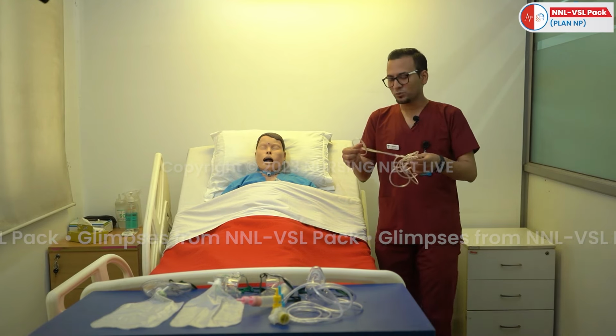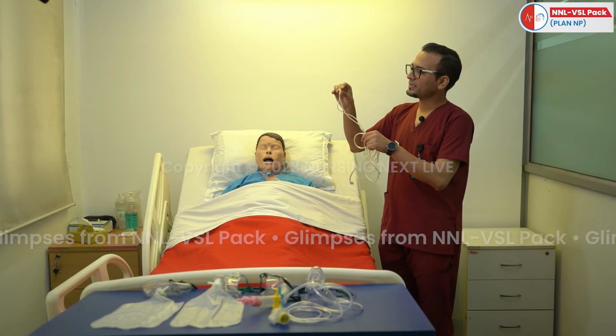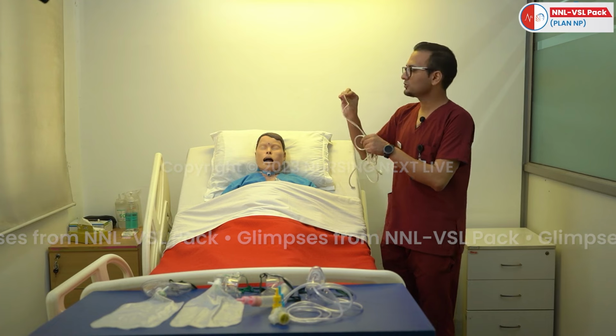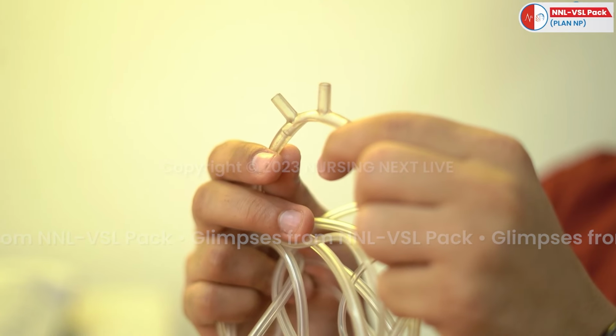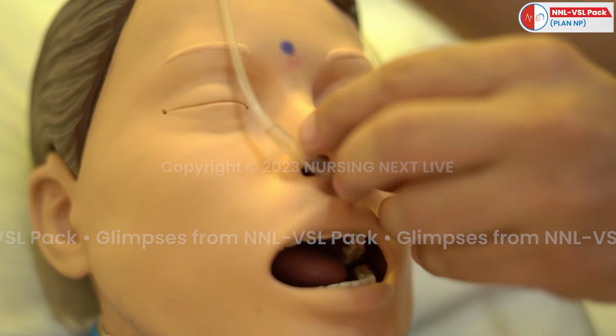In this device, you will see there is a long plastic tube, and the end of the tube is diverted into two prongs, and these two prongs we are going to introduce into the patient's nostrils. So like this, you can introduce these two prongs into the patient's nostrils.